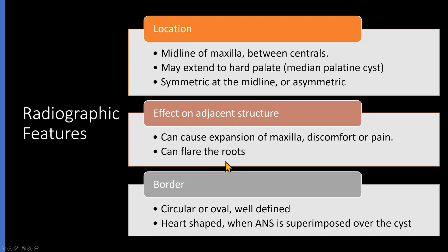Just like any other cyst, the border is well-defined. The shape is circular or oval. However, if you take a periapical or an occlusal radiograph, the anterior nasal spine may superimpose over the cyst, giving it the shape of a heart. Let's review two such cases.